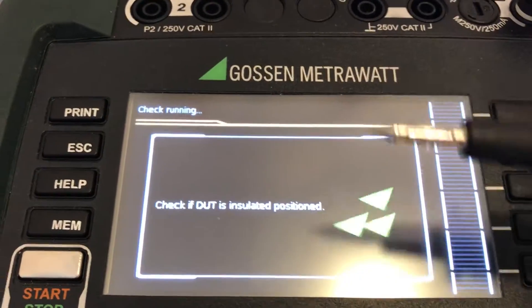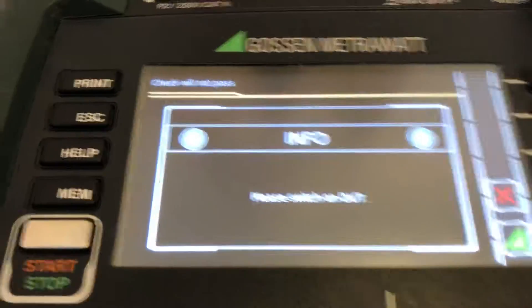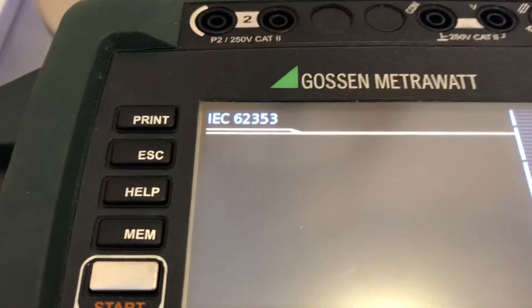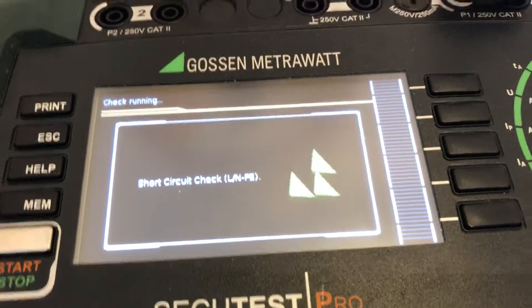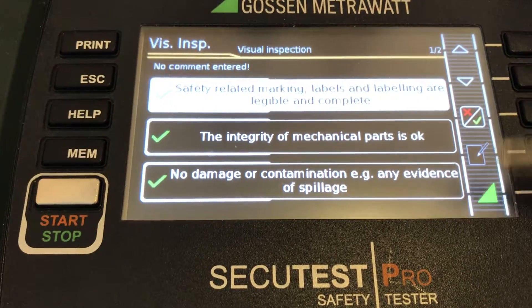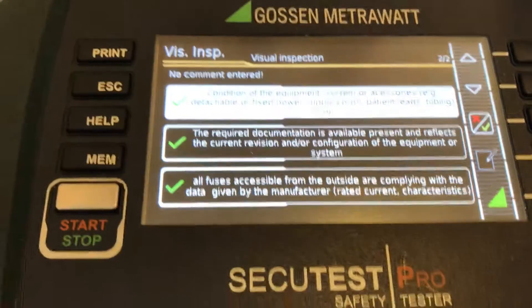Now it's checking for the probe — whether the probe is connected — and then please switch on. This is the visual inspection step where we have to decline or confirm.